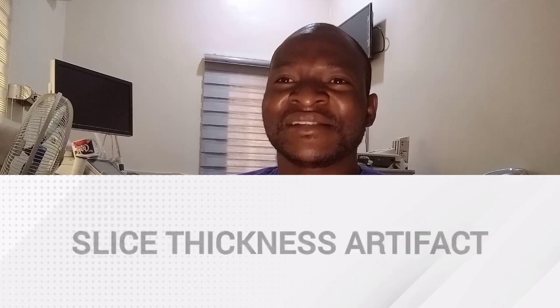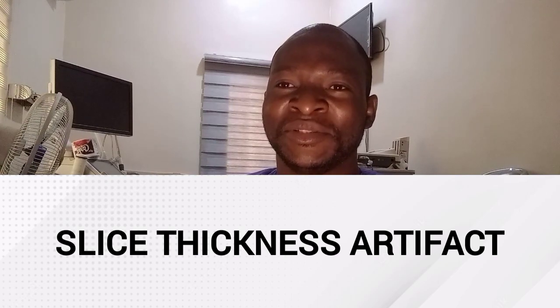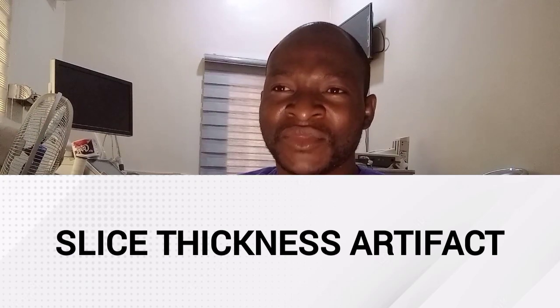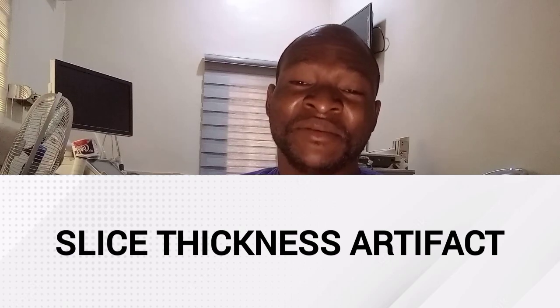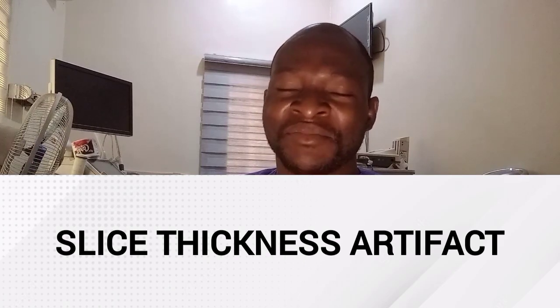Now, in slice thickness artifact, the beam width perpendicular to the direction of scan is known as slice thickness. Slice thickness also produces low-level echoes or fill-in artifact that is identical to the beam width artifact. The only difference here is that the slice thickness echo comes from tissue lying perpendicular to the beam axis, while the echoes from the beam width artifact arise from tissue lying along the beam axis.